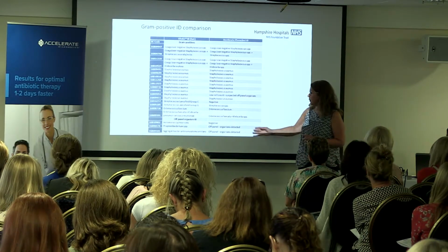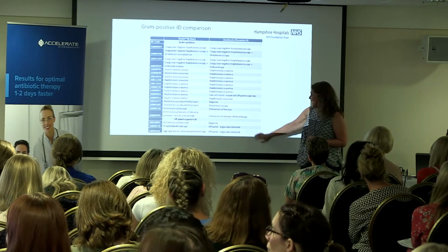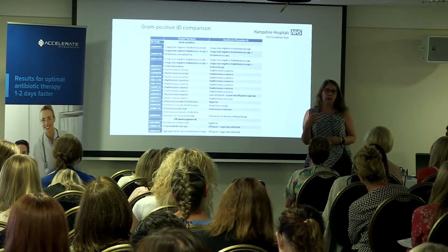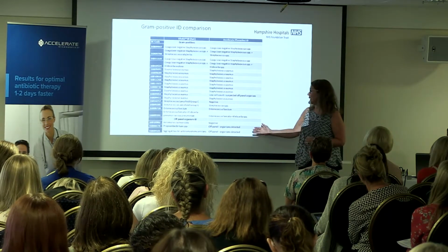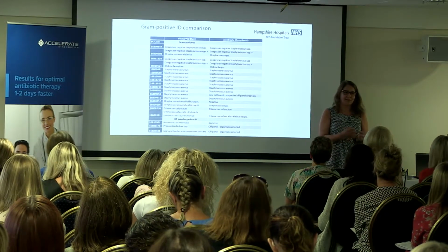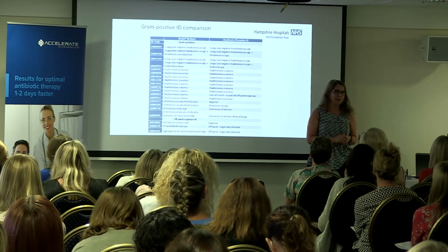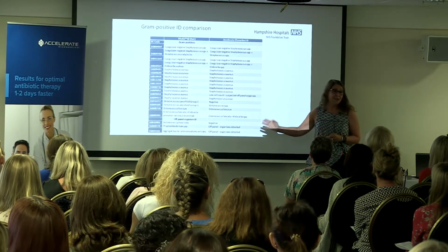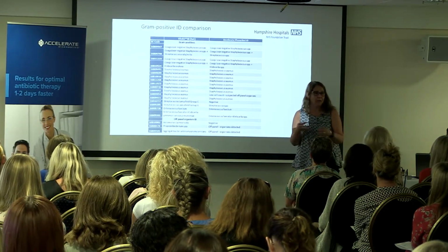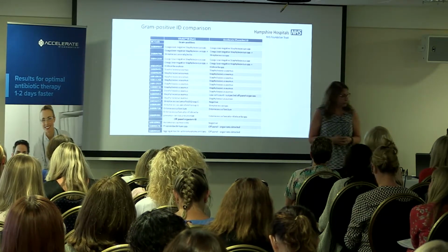There were a couple of bacteria that were off-panel, and as we're using it more frequently, more regularly, we are noticing, we had a run of patients, returning travellers, they'd come back to Basingstoke from abroad, and we had 3 patients with typhoid within a month, and unfortunately, the Pheno doesn't identify typhoid, but it did tell us it wasn't an E. coli or a Klebsiella, so it helped indirectly, as we thought it might be a salmonella.